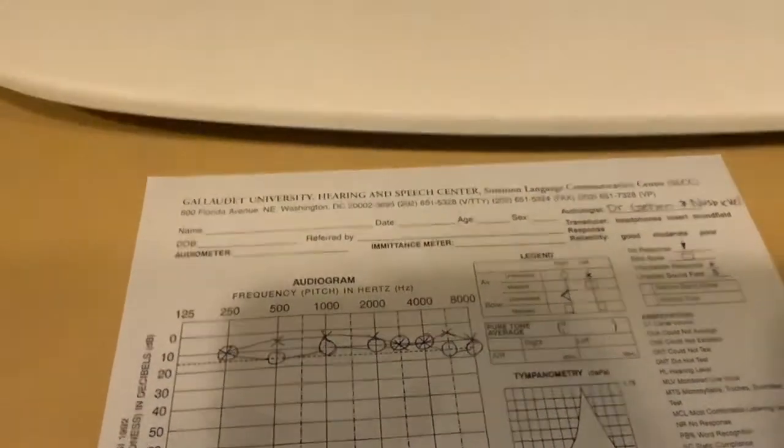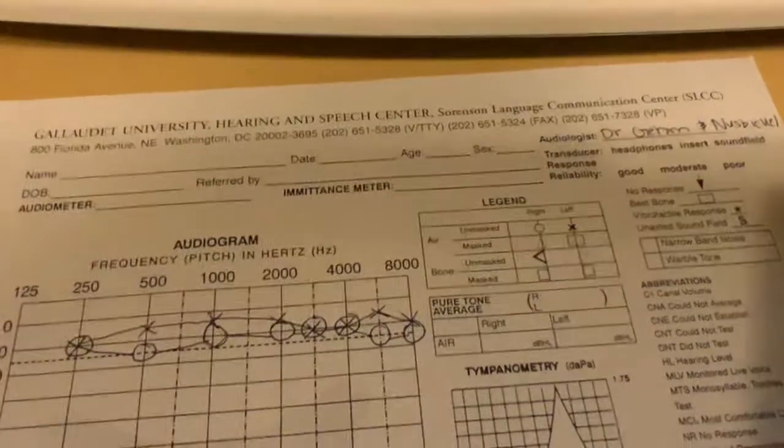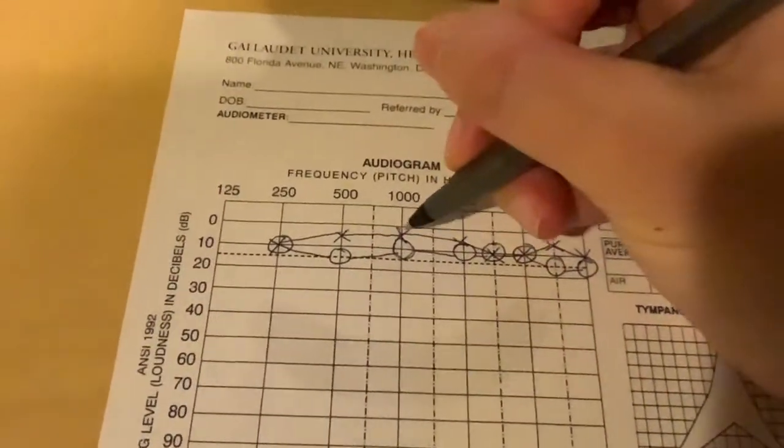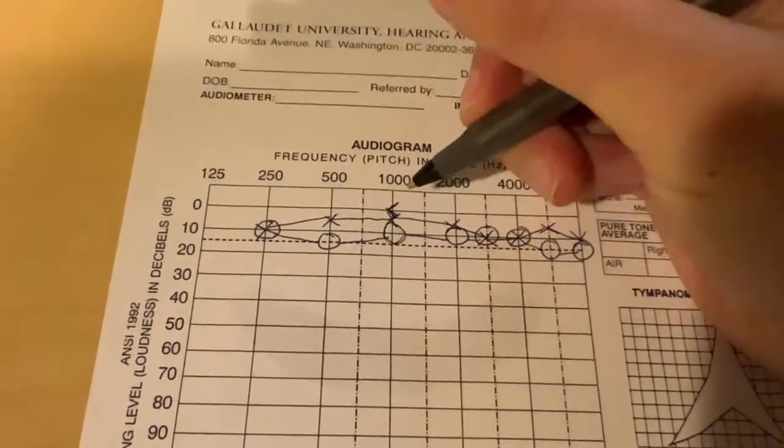And one way to remember that is that Emily's right ear is on this side and the arrow is pointing in as if it's her ear. So let's write that down. At 0 dB, we have an unmasked bone threshold right there.